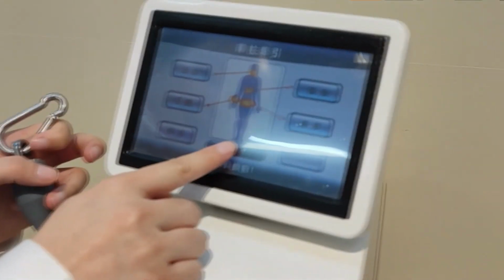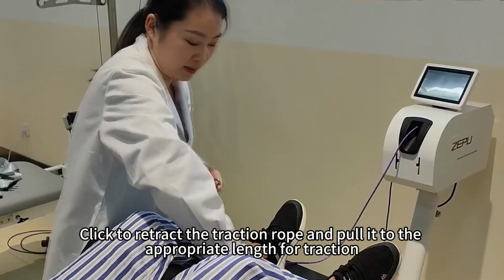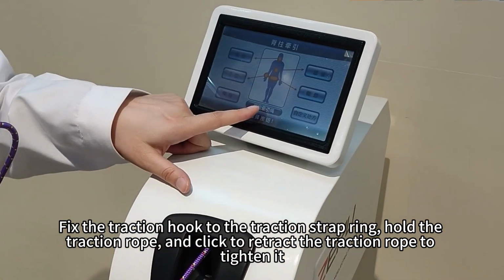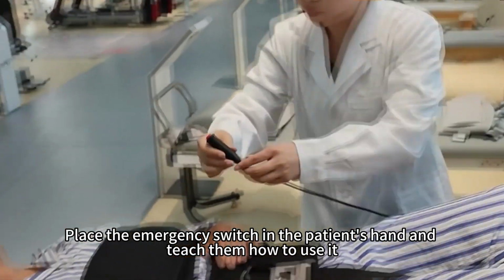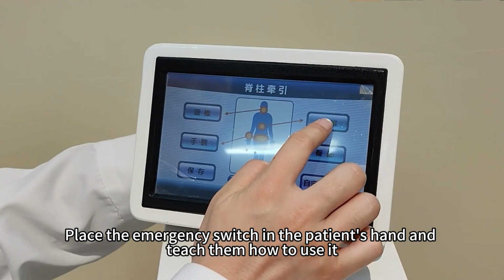Software operation. Click to retract the traction rope and pull it to the appropriate length for traction. Fix the traction hook to the traction strap ring. Hold the traction rope and click to retract the traction rope to tighten it. Place the emergency switch in the patient's hand and teach them how to use it.